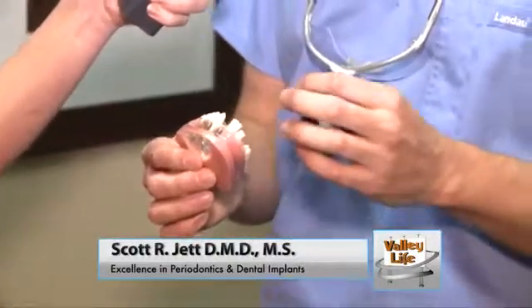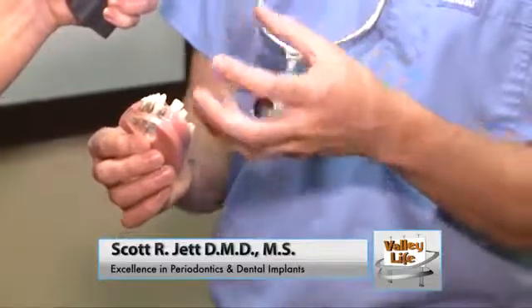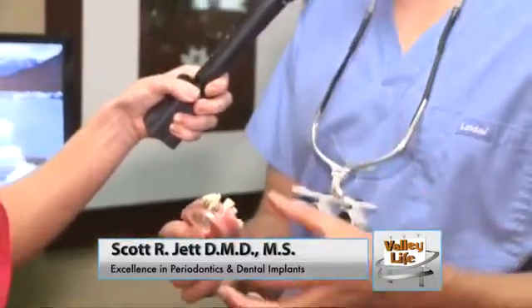Your typical patient will either have a missing tooth or have a bad tooth. If they've got a bad tooth in place, we can extract that gently and have them come back a few days later or a few months later to actually place the implant. The nice thing about dental implants now is that it's an outpatient procedure. We do it under local anesthetic, and the implant itself is nothing more than a titanium rod, maybe the size of a matchstick. That's really come a long way because it will never decay. We don't have to worry about it.